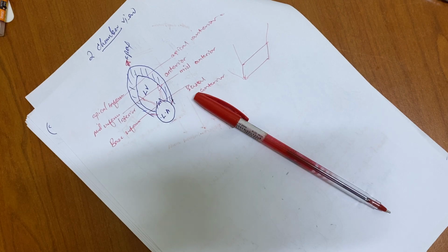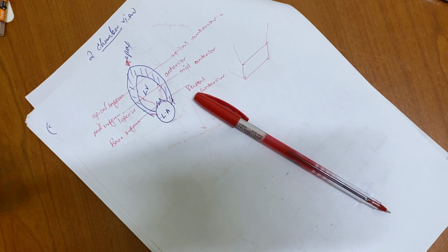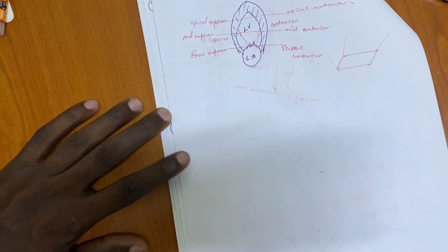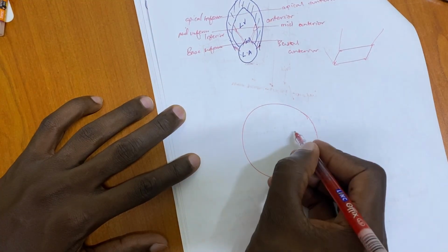The 3-chamber view, and then the 5-chamber, the 4-chamber. The 5-chamber shows the aortic, but it is not used to assess wall motion, so that's why I'm not drawing it. Maybe very fast, let's combine the short axis views with their numbers. We had something like that.